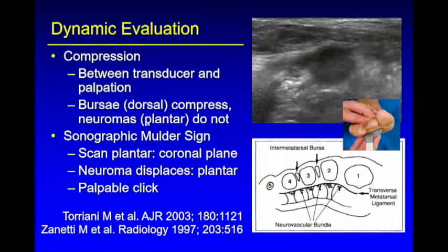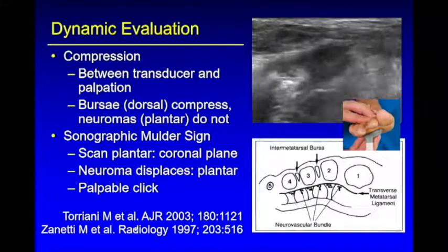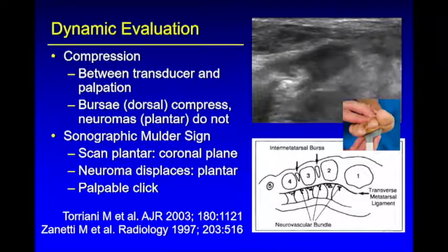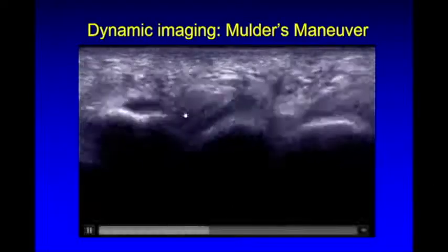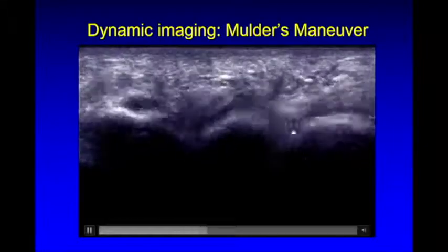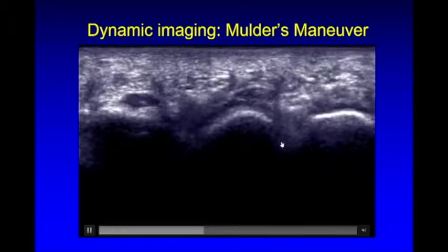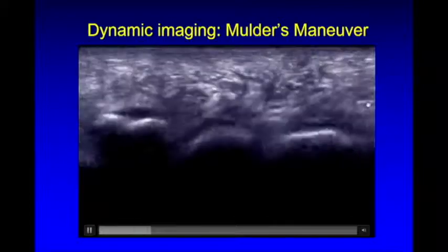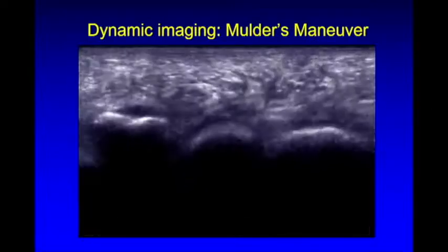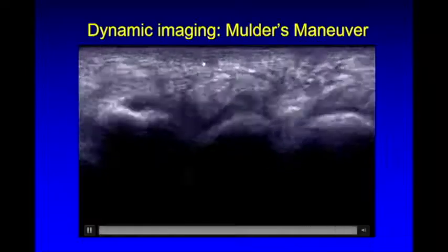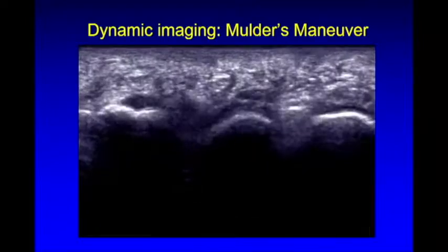The second aspect of dynamic evaluation is the sonographic Mulder's sign — for me, the most important maneuver when looking at Morton neuromas. You squeeze the foot from side to side, the metatarsal heads come together, and the neuroma snaps or moves in a plantar direction. I scan from the plantar aspect because the neuroma is pushed toward the transducer. Here are the metatarsal heads with a normal interspace — you can appreciate the heterogeneous appearance, which is why calling a tiny neuroma may be difficult. By squeezing the foot, you can see the neuroma moving plantarly; it's non-compressible, so it's not a bursa. With this dynamic maneuver, you can feel the click, and the patient will confirm it creates symptoms.